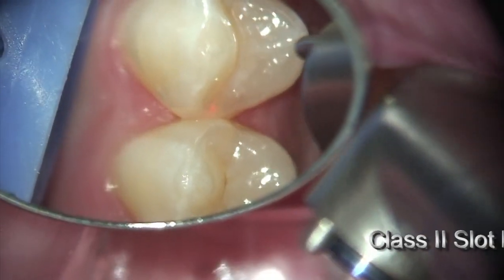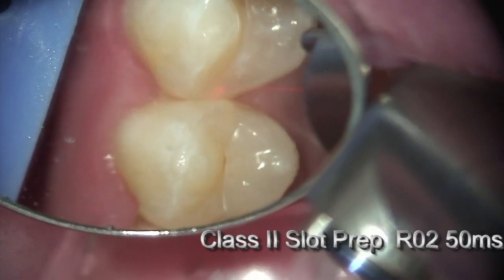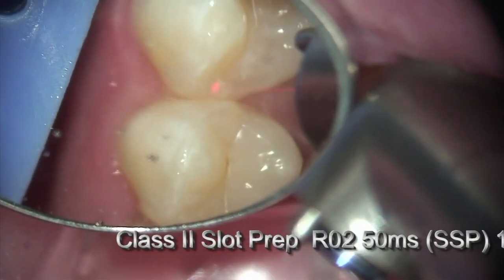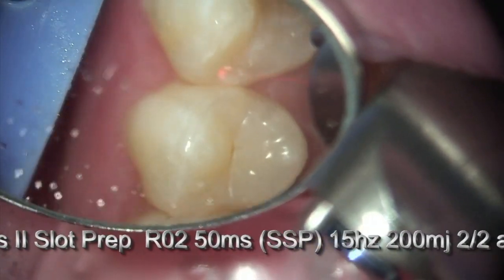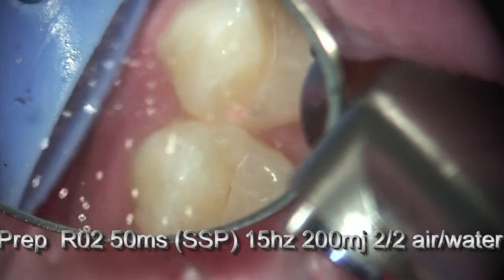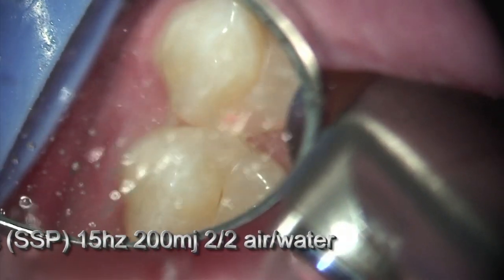Here at a Class 2 restoration, I'm going to create a Class 2 slot preparation — again, minimally invasive. Using the RO2 tipless handpiece with great visibility, I'm able to remove the marginal ridge quite efficiently and quite quickly.